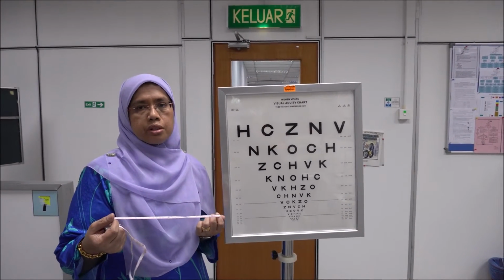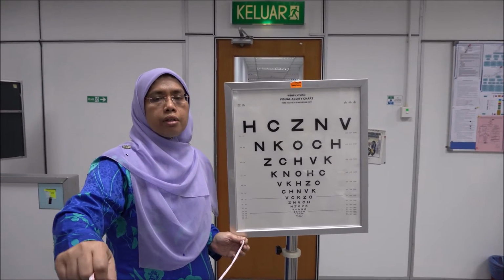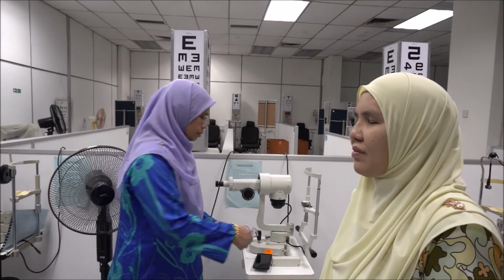To ensure that the subject is standing at 3 meters in front of the chart, you need to use a measuring tape and measure the distance from the chart to the subject before visual acuity is measured. Before taking measurements using the logMAR chart, ask your subject or patient to remove their glasses or contact lenses first. Occlude the left eye using the palm of her left hand and start taking visual acuity using the logMAR chart, following a similar procedure as you have done using the Snellen chart earlier.